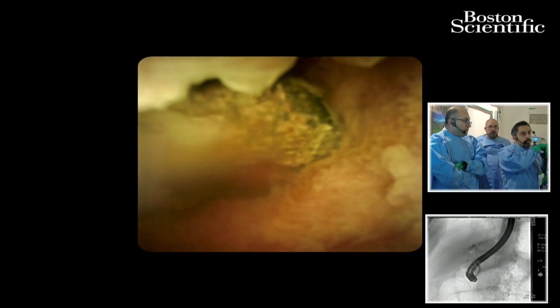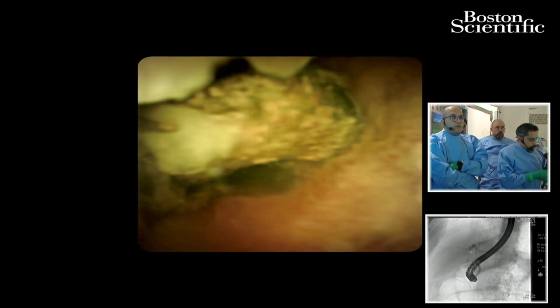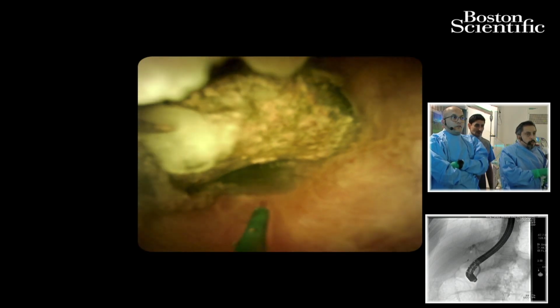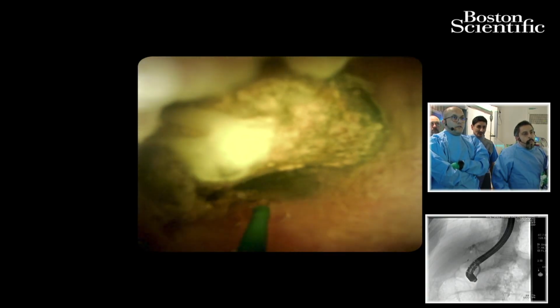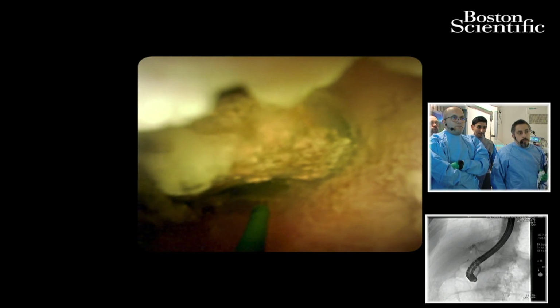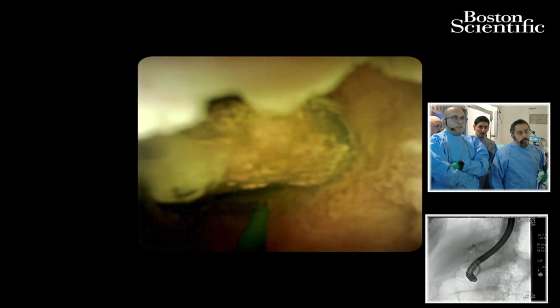Okay, that's very good to know. I mean, it's easier now to dilate even with the SPY. I mean, with the dilation, like sphincteroplasty, it makes it easier to extract the stone. What do you think of doing that as well, even with the fragments after fragmenting it with laser or EHL? Usually, if there is no stricture, you can dilate and make it easier for you to extract those fragments. What do you think about this?